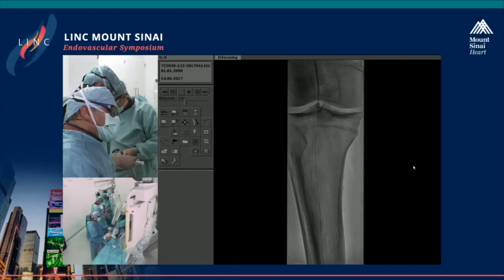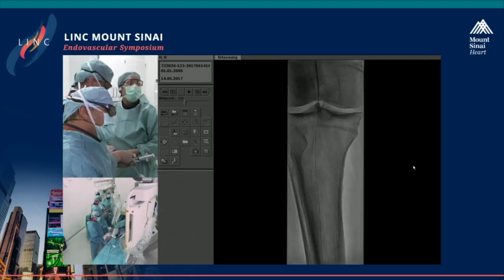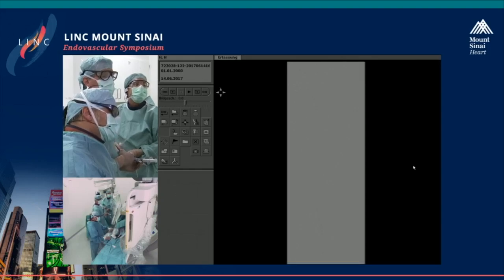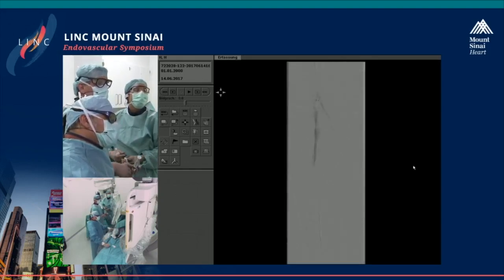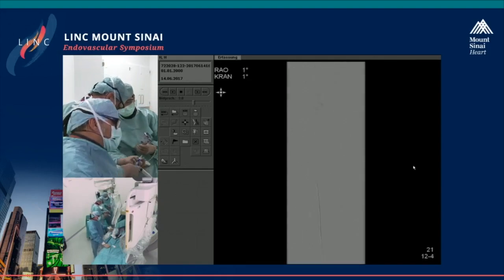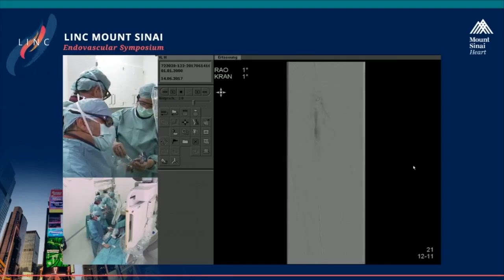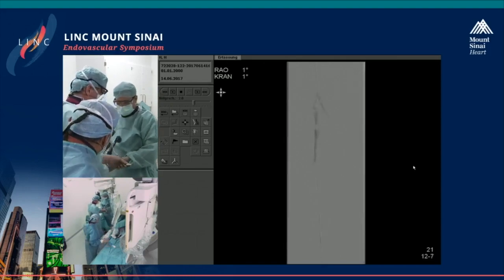I mean, there's a concern, of course, that if you inject something into the wall, you may somehow interfere with your vessel lumen, but as a matter of fact, you're injecting into the adventitia, so there's a lot of space for the fluid to go. So we typically see the lumen is as perfect as it was before the treatment, after the Bullfrog. And you accept the 20% residual like you would with the DCB since you're giving antiproliferative therapy?